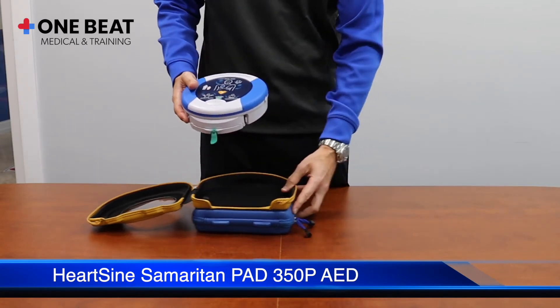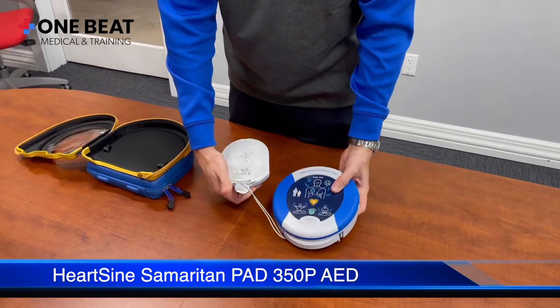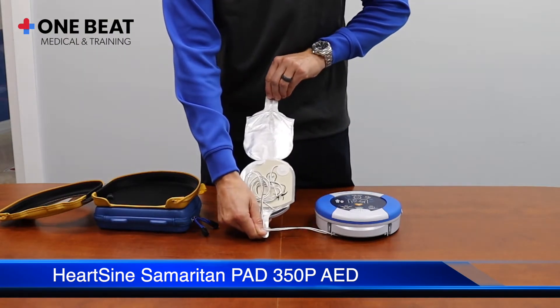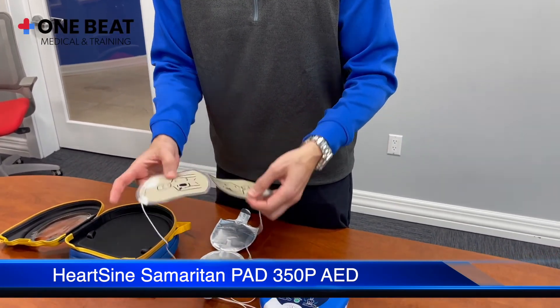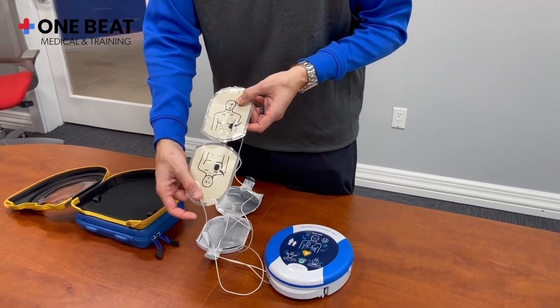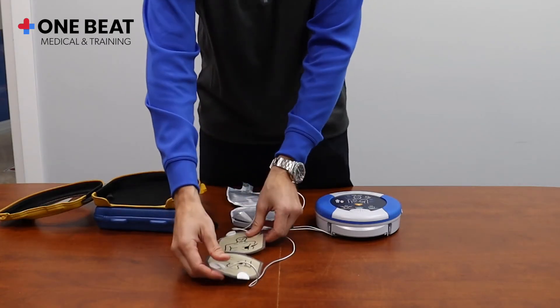Pull the green tab to access the electrodes and peel back the seal to expose them. Look carefully at the pictures and place the pads exactly as shown onto the body. Only two buttons — on/off and shock — are required for straightforward operation. Please visit our website to learn more about our products and services.